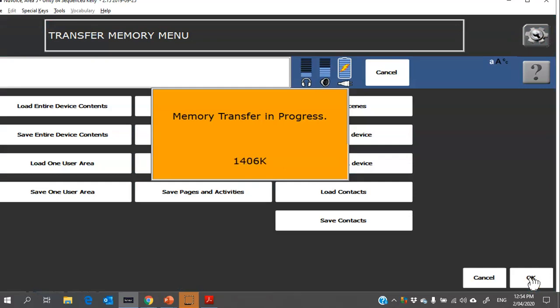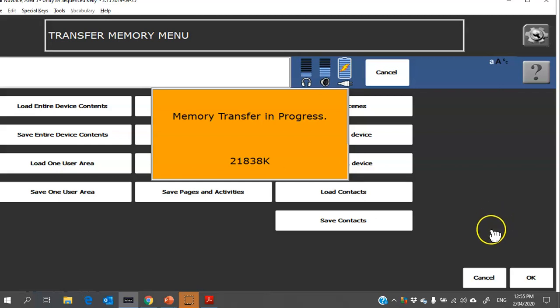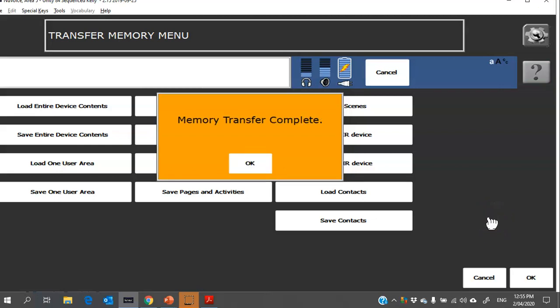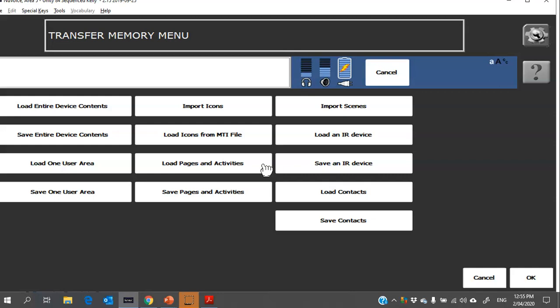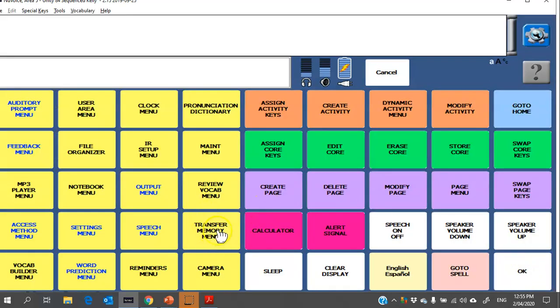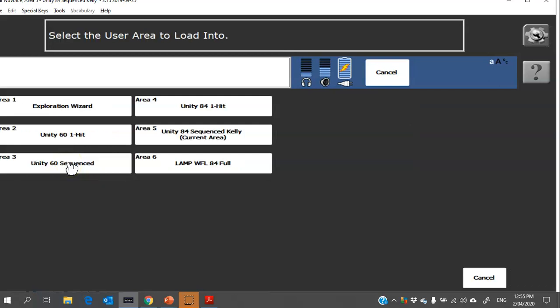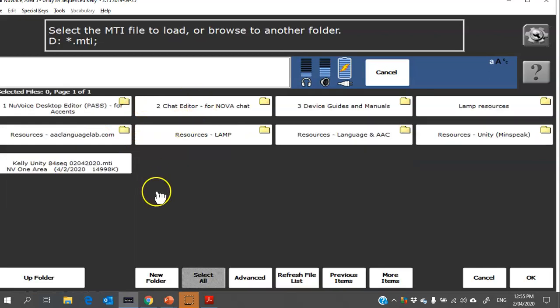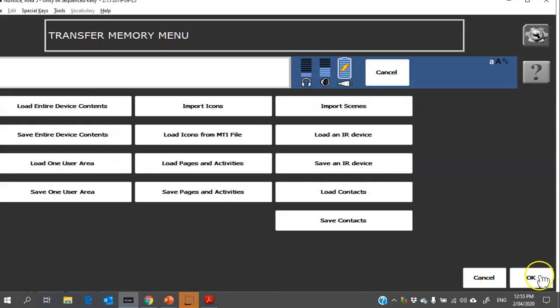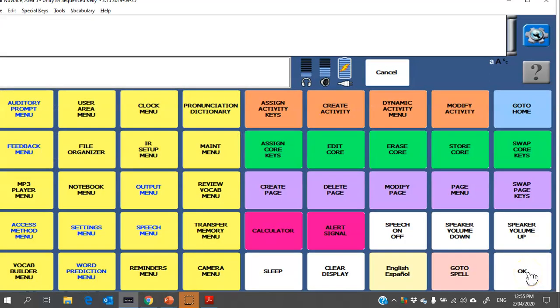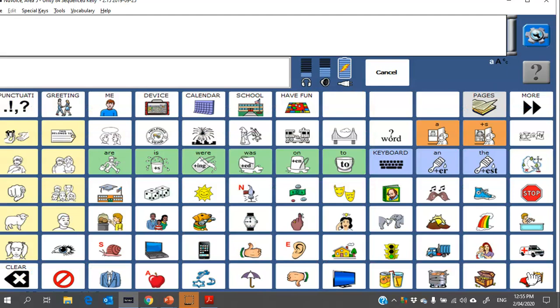You'll see it will transfer is in progress. So that's saving that whole user area onto my USB stick. While that's loading, after this step you would take the USB stick out of your computer where the PASS software was loaded and you've done your customizing. Take it over and plug it into the Accent. You would load this same transfer memory menu, but in this case you're not saving one user area. You're actually going to say I want to load that user area. So I want to load it off the stick and onto the device. You would pick a spot, so I'm going to pop it in here, and then it would take you out to your USB stick, find the file, and then it will basically bring it across and load it into the device.